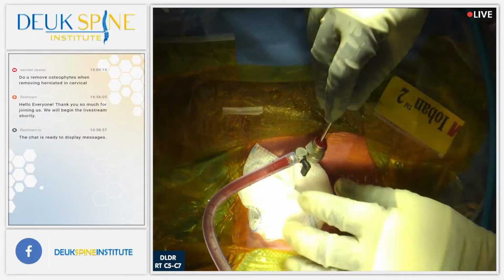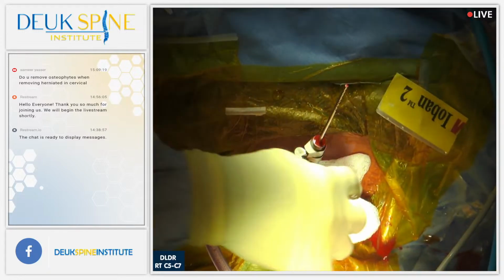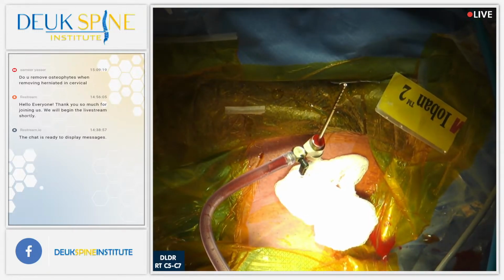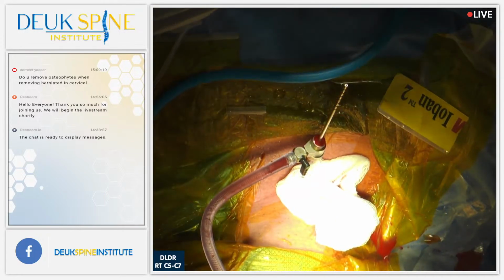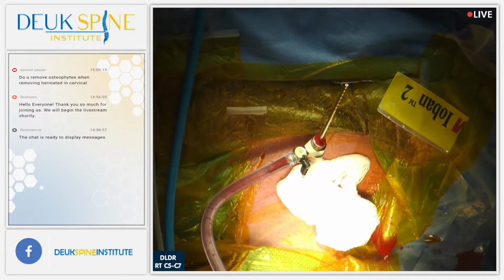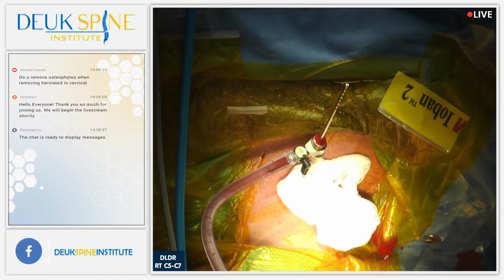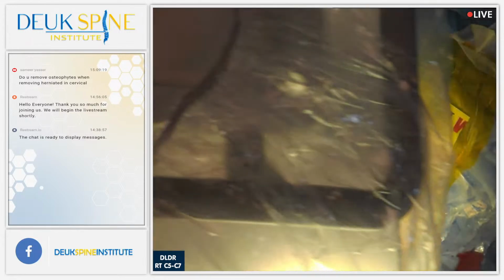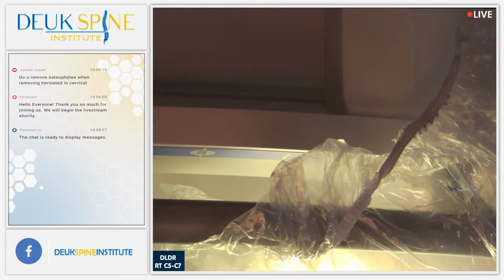All right, at this point, I'm going to try to move down south and get the next level. This will be the hardest part of the surgery. I do need that step up, just till we get in.